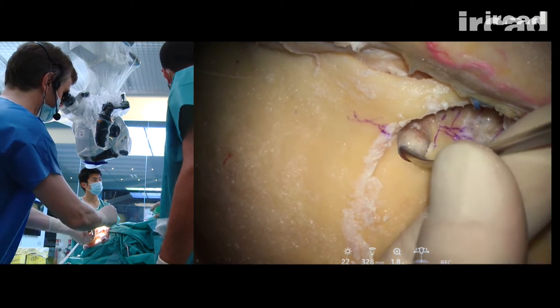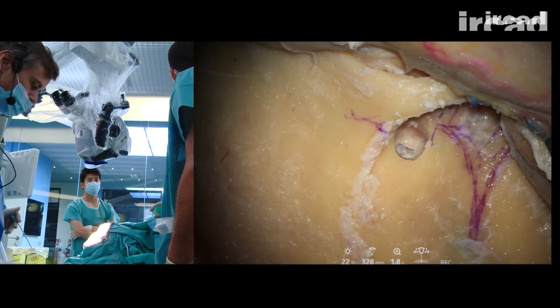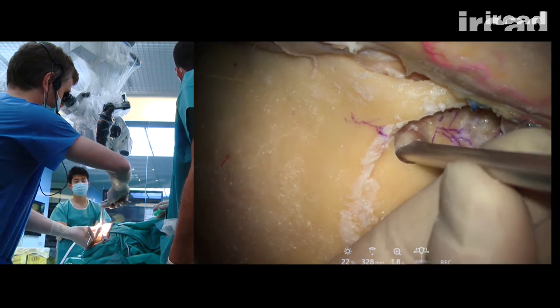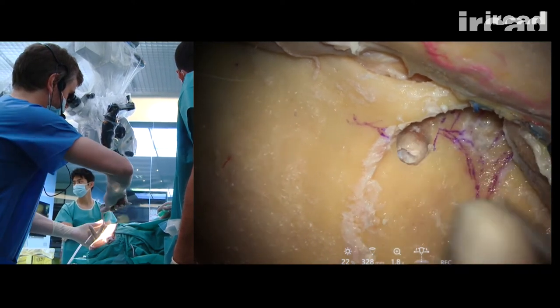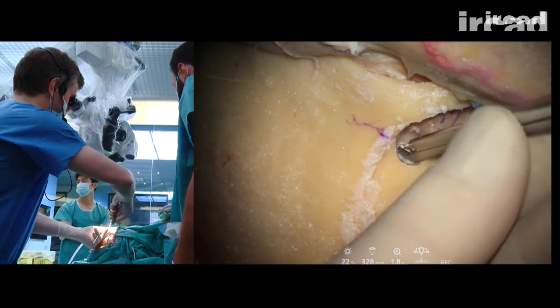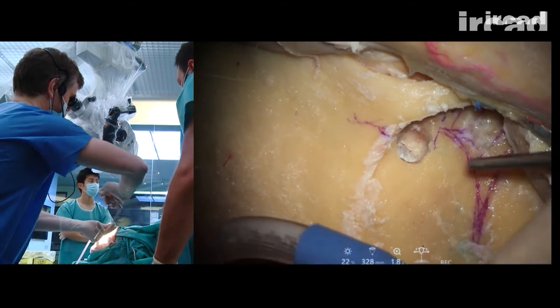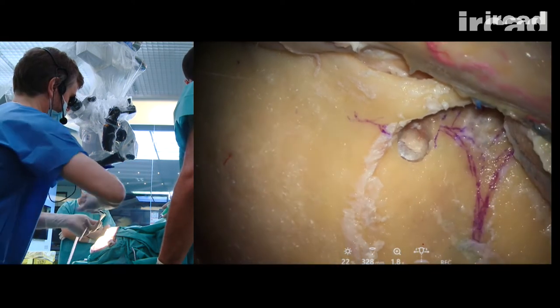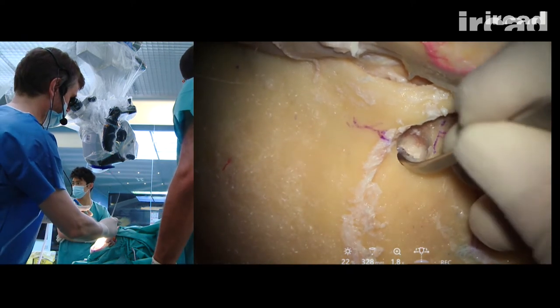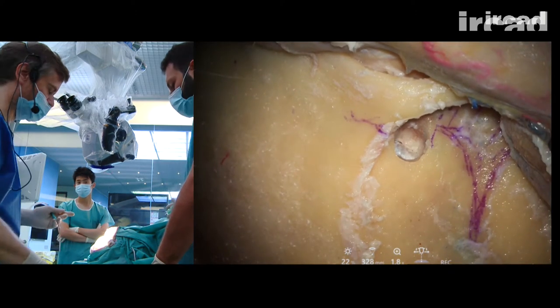So now I have this bridge of bone between the frontal dura and the orbit that I can progressively increase in size. Using a Kerrison rongeur here is a good option to make it bigger. The dura seems very thin here. So if I want to keep it intact, I need to be quite careful. It will probably be tough to keep it completely intact.